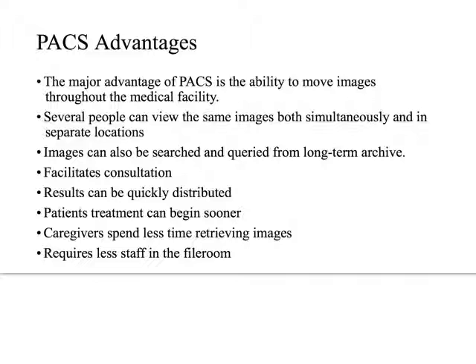So the major advantage of PACS is we can move images throughout the medical facility and even into other areas of the world at the click of a button. Several different people can be viewing the images at the same time, and we can search the images really rapidly. In fact, we can have the robot search the images ahead of us.